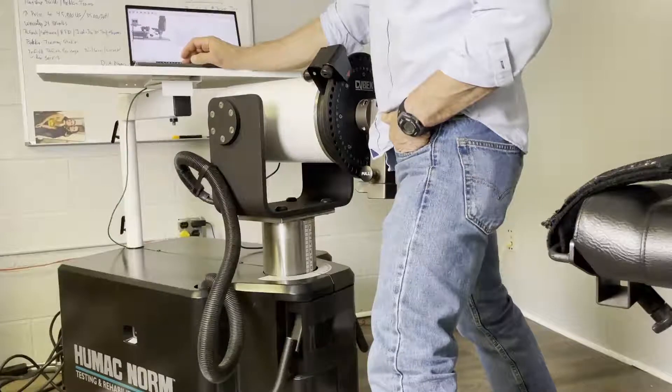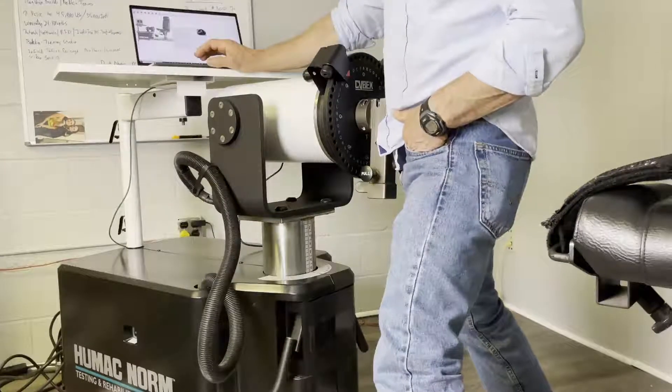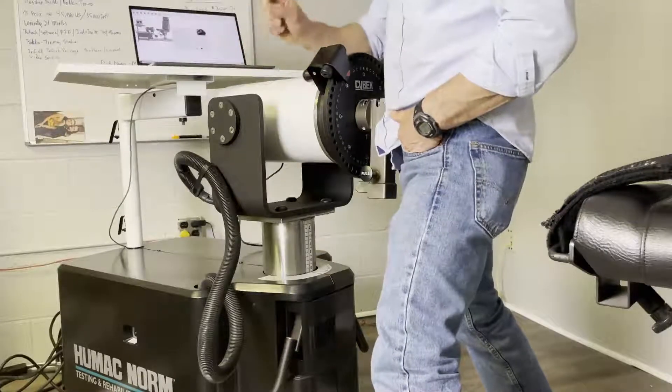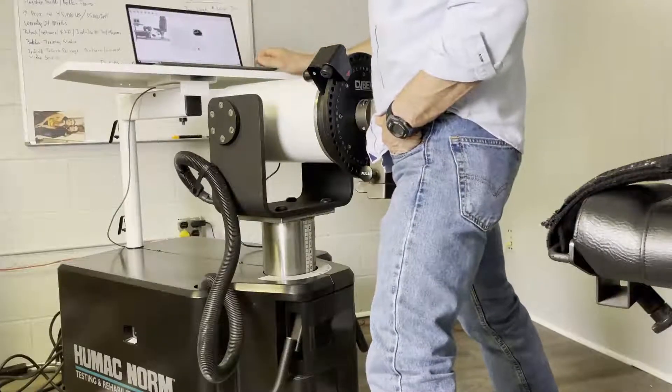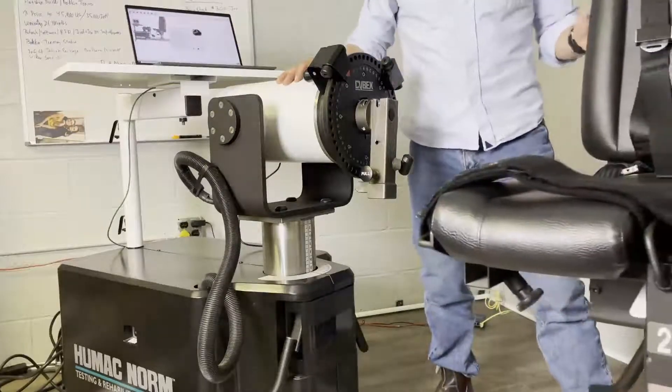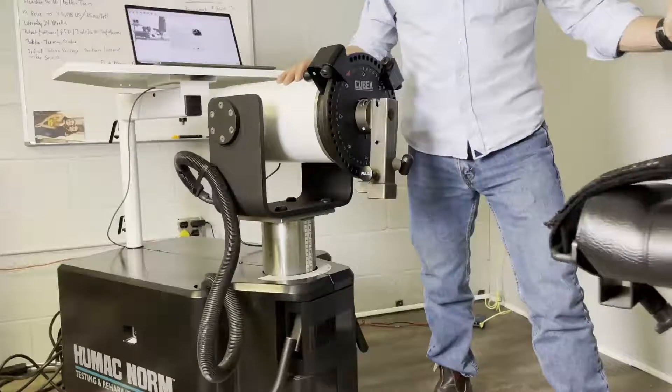Then you want to click calibrate torque. What you do is read each sentence, and once all the sentences are completed, you click the checkbox. The first sentence says move the chair away from the dynamometer — so here's the chair, away from the dynamometer means away from the dynamometer.